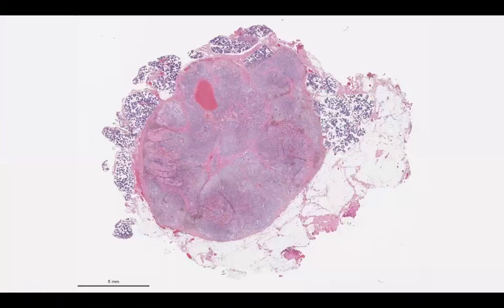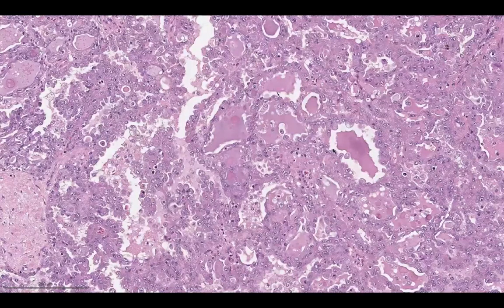All right, 40-year-old male with slowly growing parotid mass. And look at this. Similarly, a circumscribed lesion that looks sort of encapsulated, but it is pushing here into the surrounding parenchyma. And then on higher power, we see cells that do have a bunch of cytoplasm, but in this case, the cytoplasm looks a little more eosinophilic, and they are in something that looks like a microcystic pattern, but they also have this unusual colloid-like material with these bubbly secretions here.